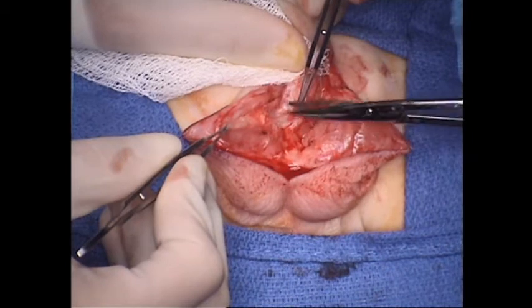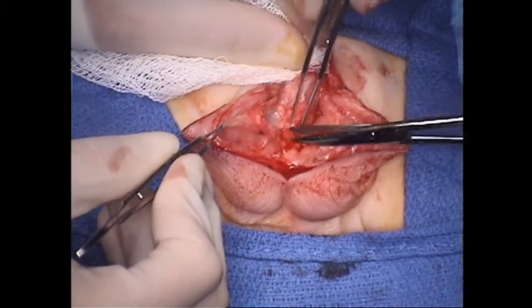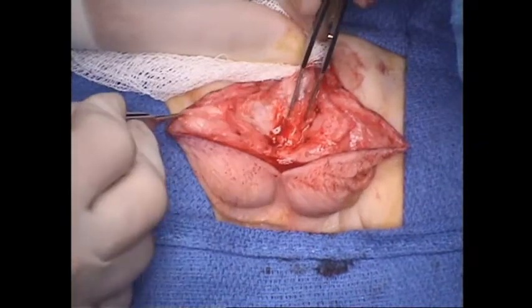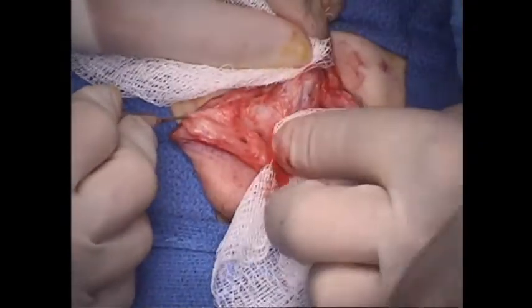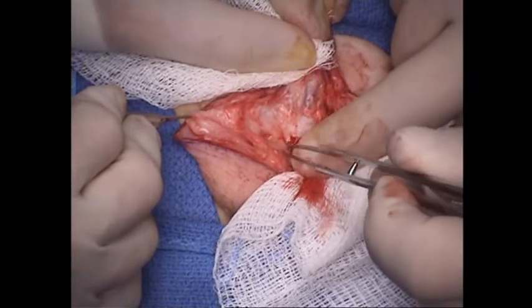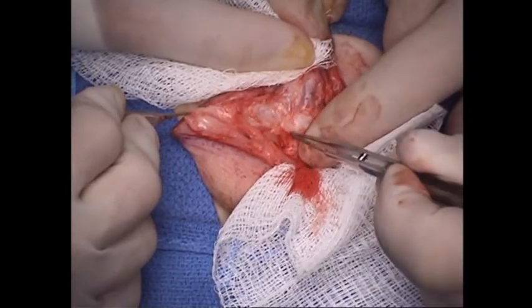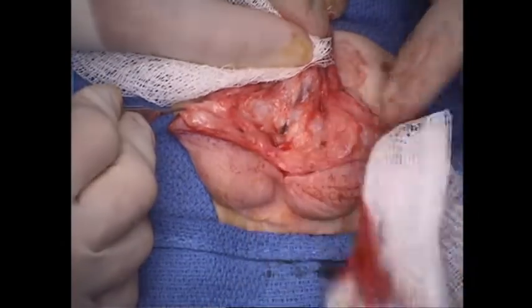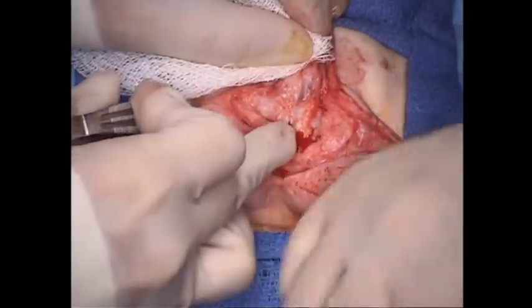In terms of skin closure, we want to give the appearance of the longest possible penis here. So that's another reason to really drop this scrotum down. All of these little nuanced things make a big difference in the postoperative appearance. Oh, one more.